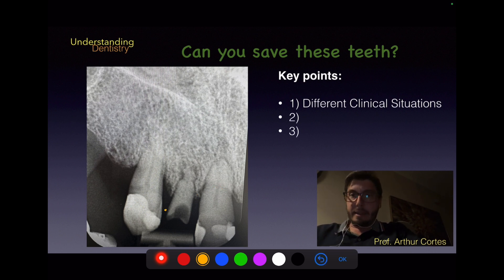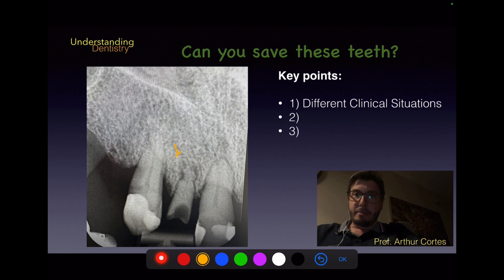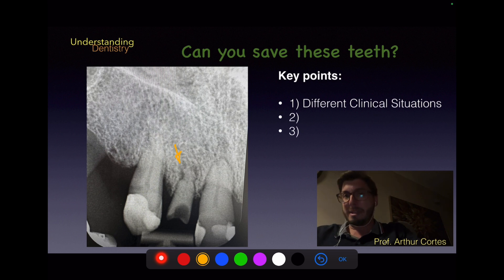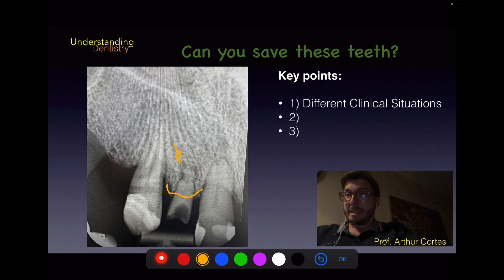Now for the lateral incisor: there is no restoration, the crown is missing, the pulp chamber is exposed, and there is no root canal treatment. We can see a periapical radiolucency — periodontal ligament space widening has progressed to the beginning of a periapical granuloma, also with external root resorption. Look at the dimensions of this root and the bone level.